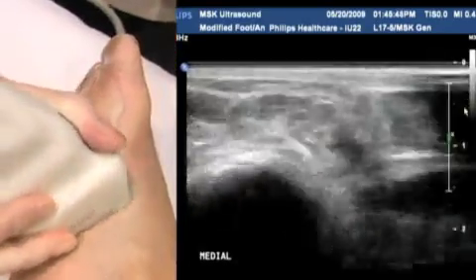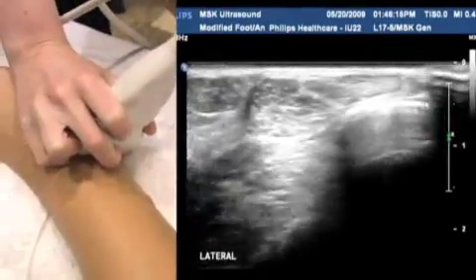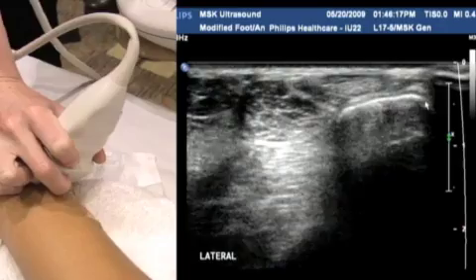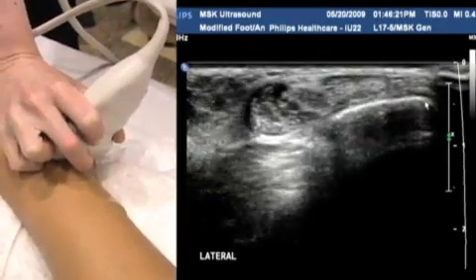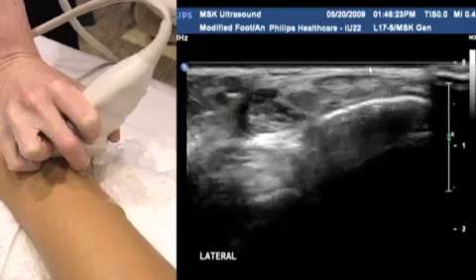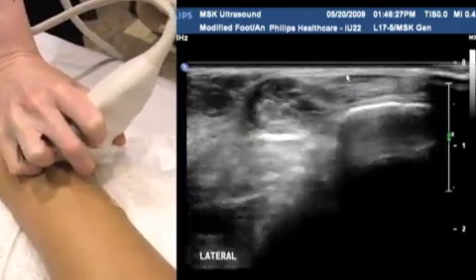And they're the major structures medially. So let's go laterally. So if we can roll over the other way so we can see the outside now, we're almost done. So laterally, we're going to be looking mostly at the peroneal tendons. They're paired tendons that share a common sheath, the peroneus brevis and the peroneus longus.